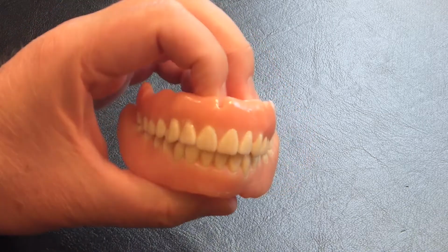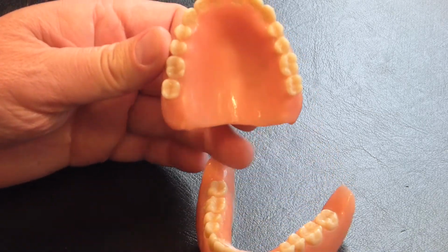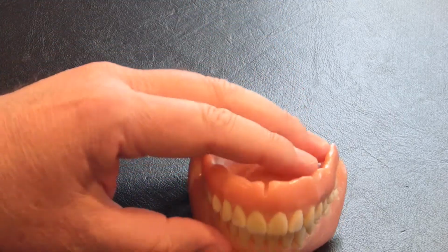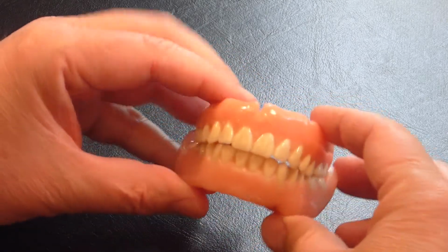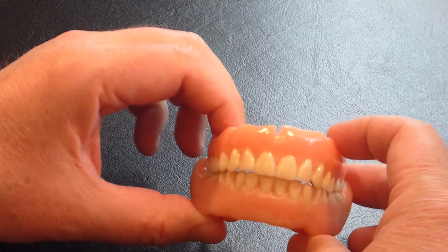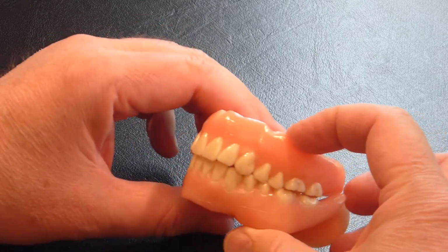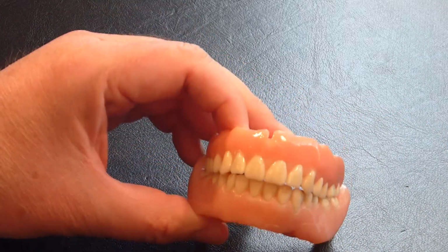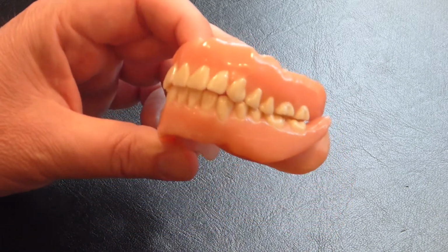On the plus side, dentures tend to be the most affordable way to replace your missing teeth. They've been around, techniques have been around for a long time. Nowadays they're getting kind of overshadowed with things like implant retained teeth, overdentures, all on four type setups. But these still work for quite a few people.